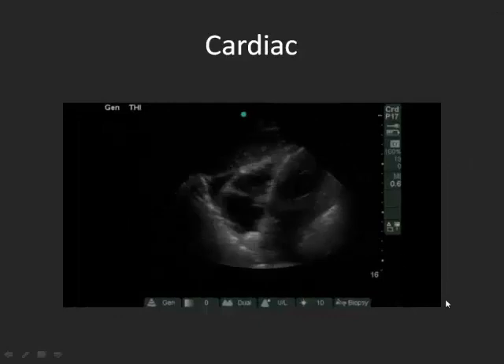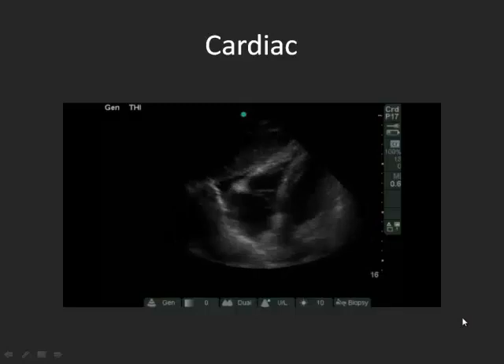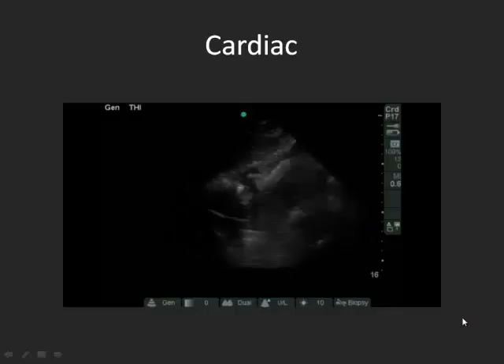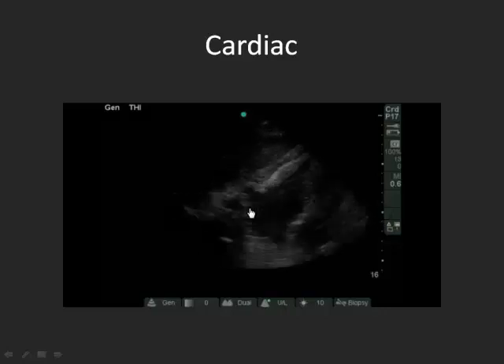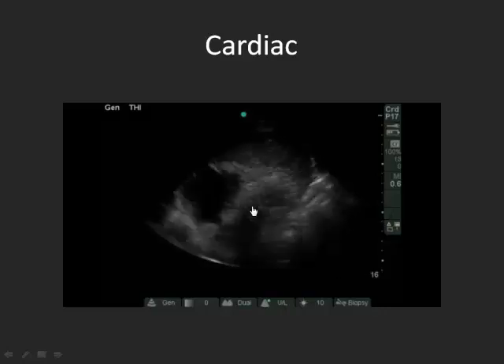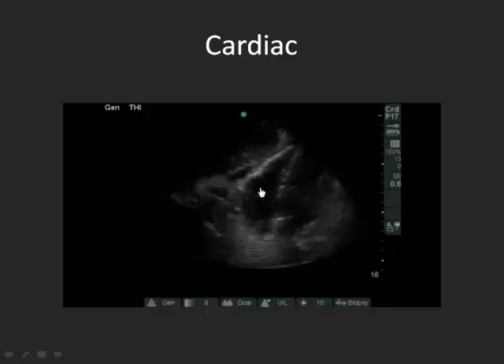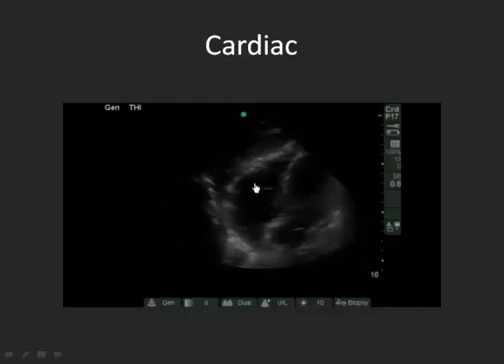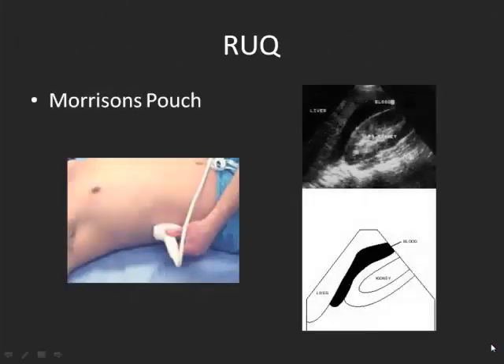So is this a normal heart? No. There's a little bit of pericardial effusion. One of the things you're assessing for is whether the right ventricle collapses during filling — it's really collapsing only when it's squeezing. So this really isn't tamponade.